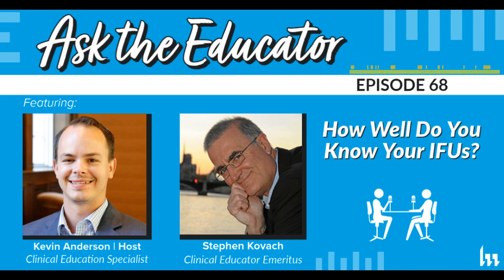So I'd like to say to our listeners, use the IFU to put in quality in your department, and use it to help explain why you need equipment and staff. But also use it to explain to your staff why this IFU is being followed, because the manufacturer did a lot of work to say, if we follow this, you should not have any issues, from testing it to cleaning it, picking the brush, detergent, and so on.